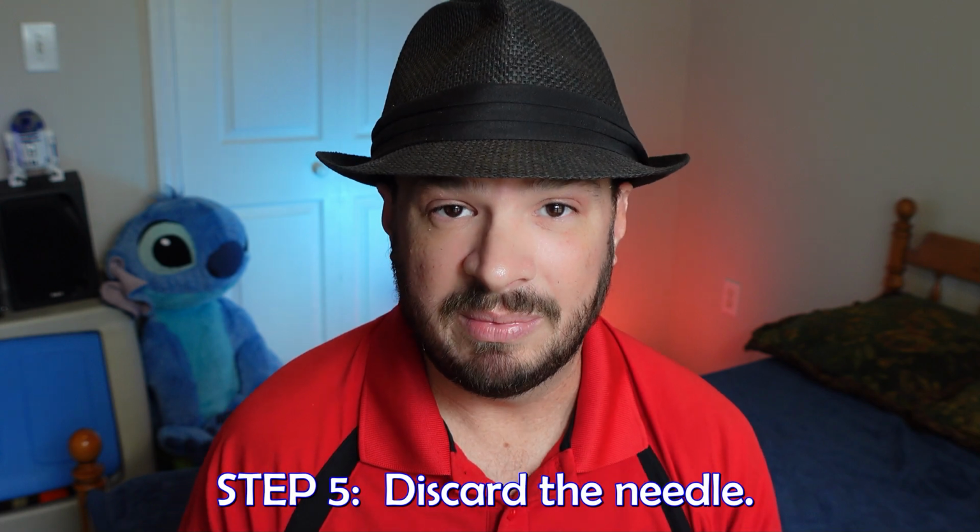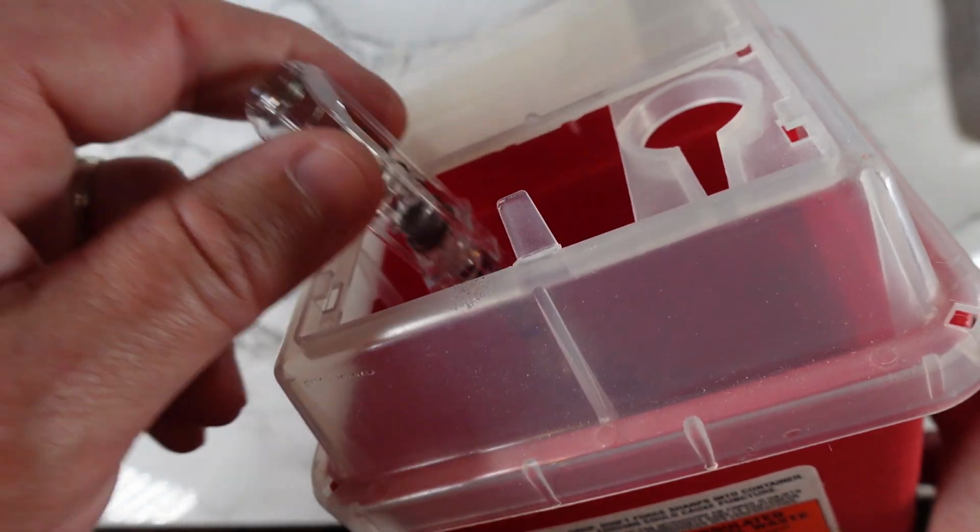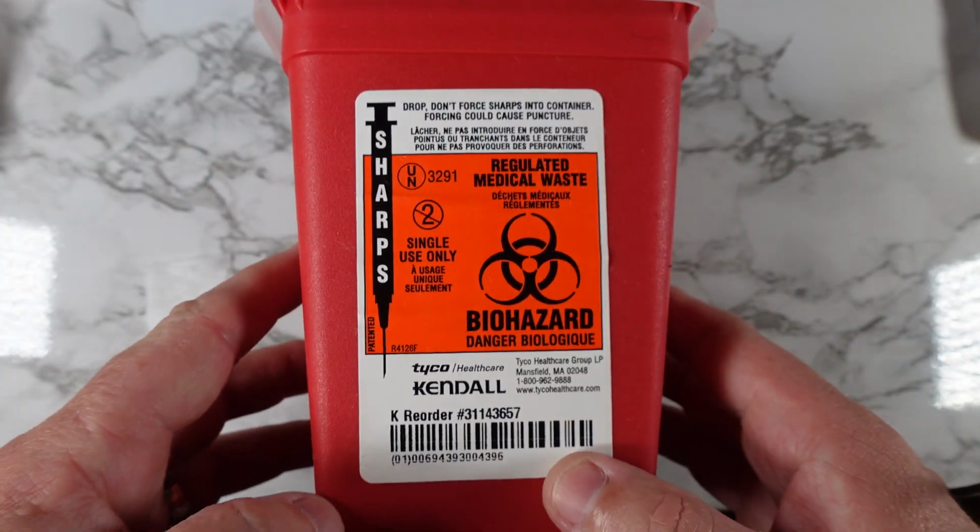Step number 5 is discard the needle properly. You want to make sure that you get a sharps container to discard the needle. Now the pharmacy that I order this from is CVS Specialty Pharmacy. It has an option to be able to add a supplemental item to it where I can have them ship me a sharps container with my medication.